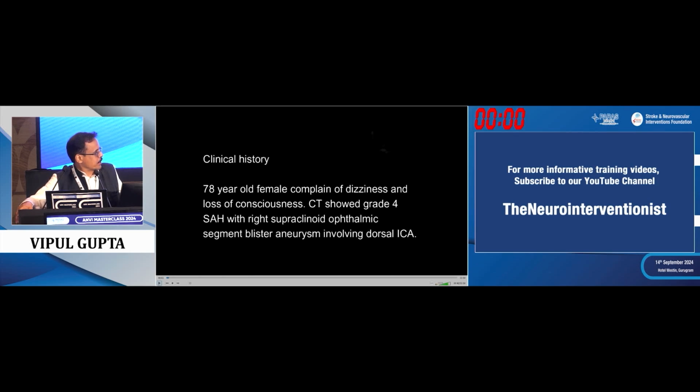So, we can have some comments. Somebody would like to use 2 flow diverters. Does somebody use coils with the flow diverters? Anything different one would like to do?